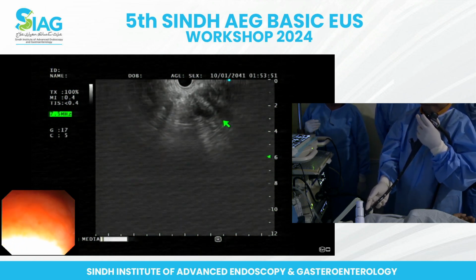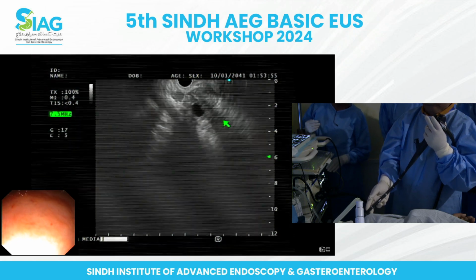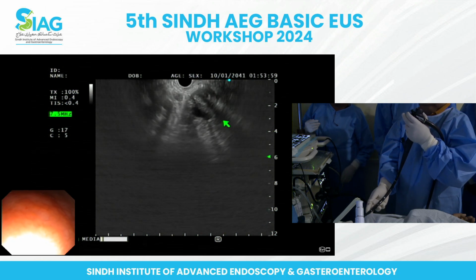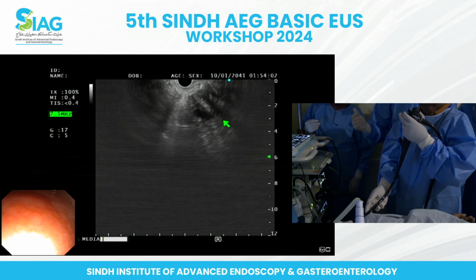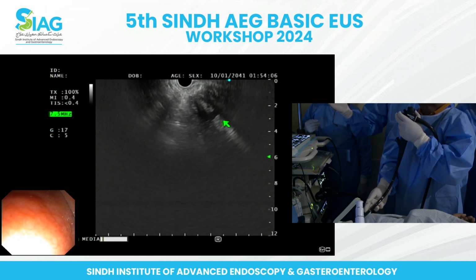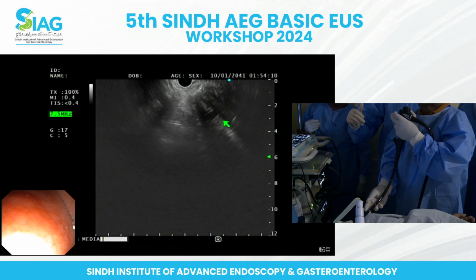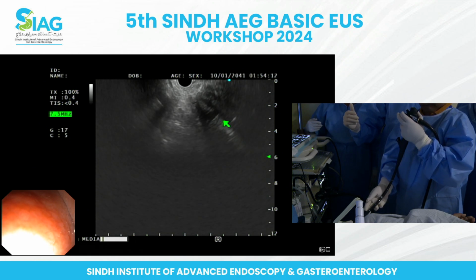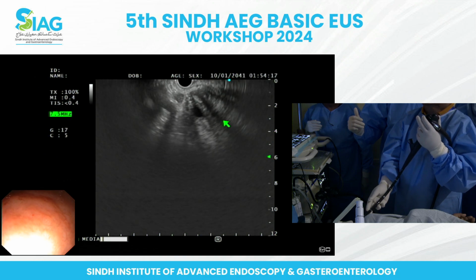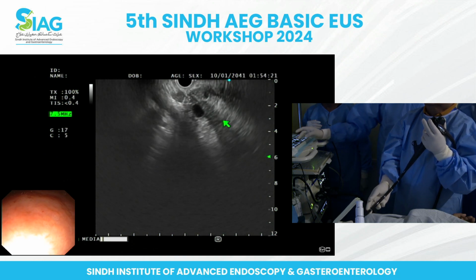Okay, right. Now follow to the right, follow to the left. Okay, trace. Go clockwise. We are going towards the body of the pancreas, neck of the pancreas. So it's dilated. So follow to the clockwise side, to the counterclockwise side. We are going towards the papilla side. Follow. And once we are at the papilla, we have a lymph node over here.